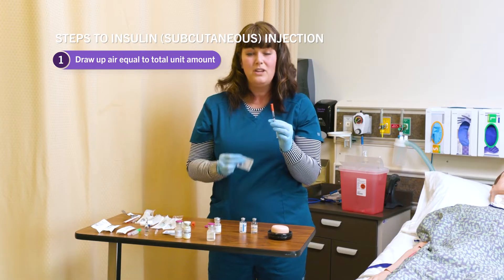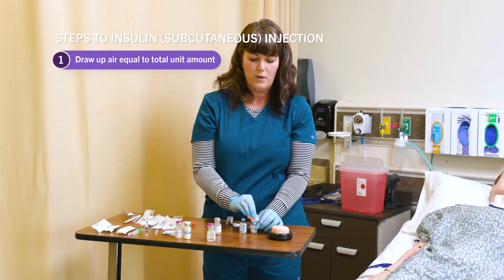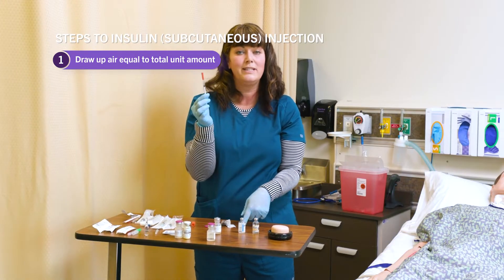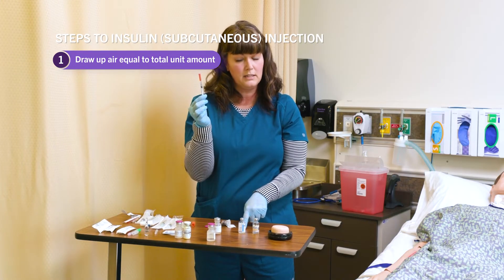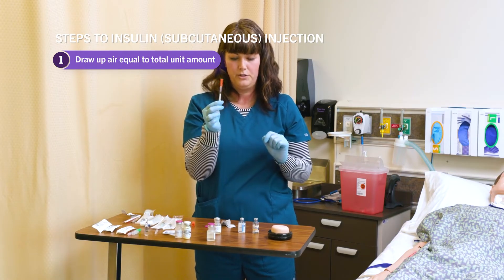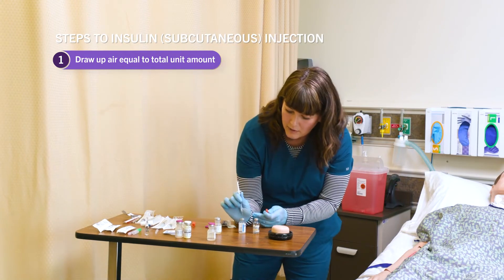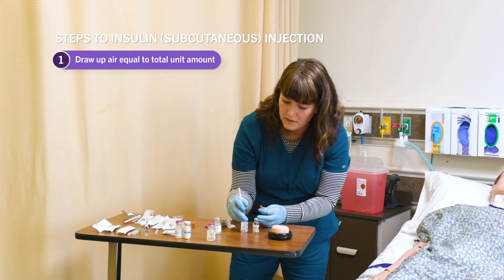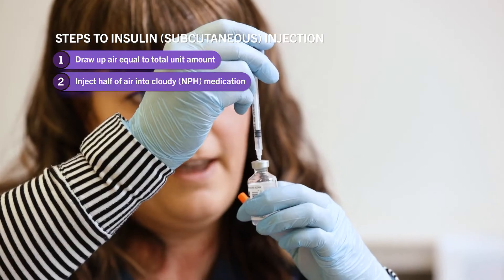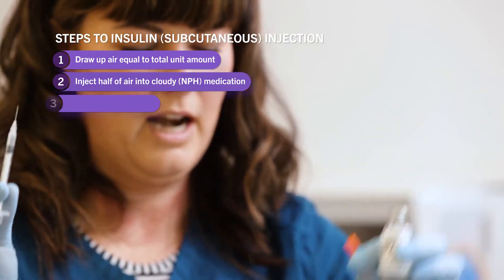These are reusable vials, which means I have to clean the tops before I access them. I scrub these vials with alcohol for about 20 seconds. The last vial I am going to access to draw up insulin will be the cloudy, so I need to inject 10 units of air into my cloudy vial first. I access this vial, inject 10 units of air, and pull out of that vial.